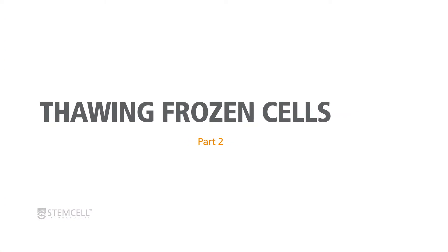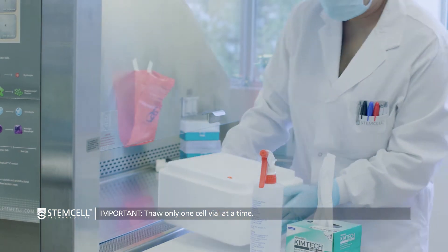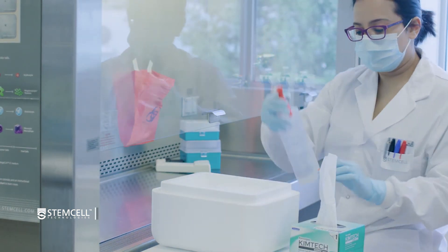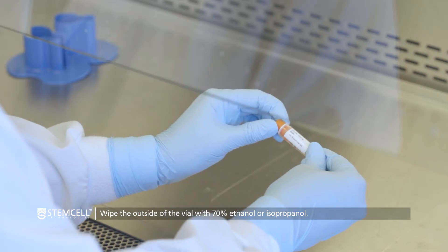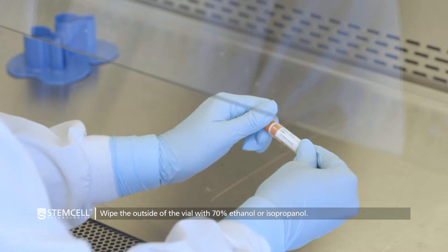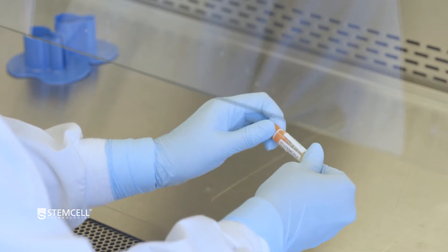We recommend thawing only one frozen cell vial at a time to prevent prolonged exposure to DMSO at higher temperatures. Wipe the outside of the vial with 70% ethanol or isopropanol. In a biosafety hood, twist the cap a quarter turn to relieve internal pressure and then retighten.